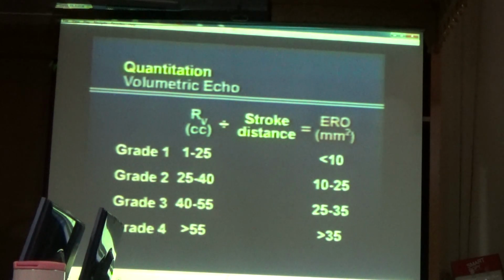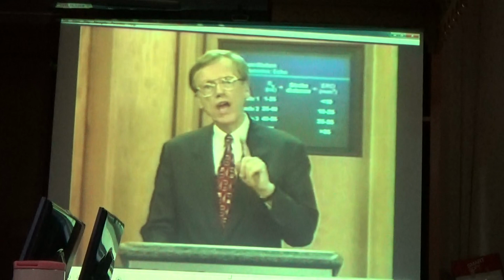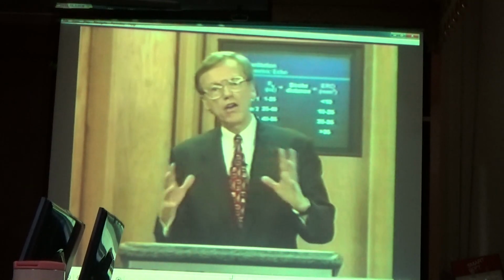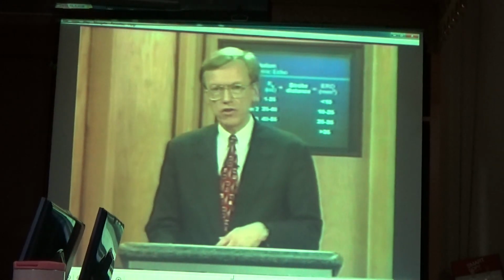So we have three well-used, well-proven techniques. Note that this cannot be done very easily at catheterization. So this has changed our clinical practice. We do it on virtually all patients who have the following: eccentric jets, or a large area of the left atrium covered, because we'll tend to overestimate the degree of regurgitation.